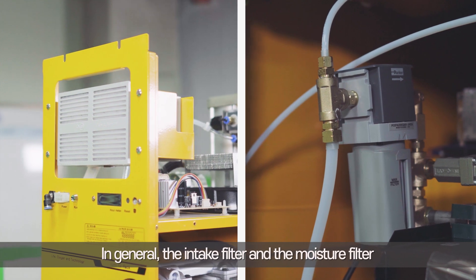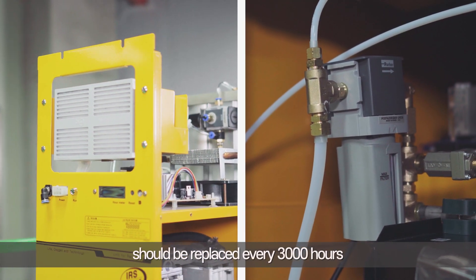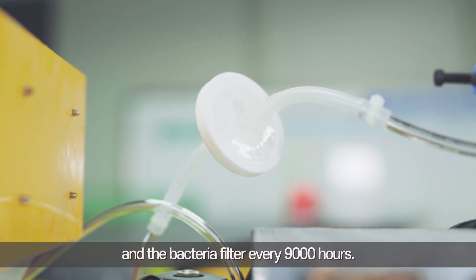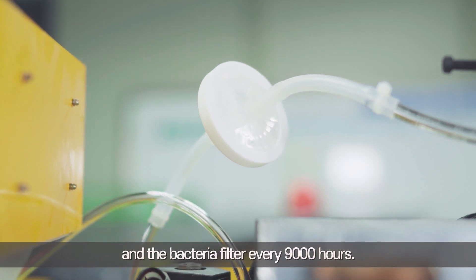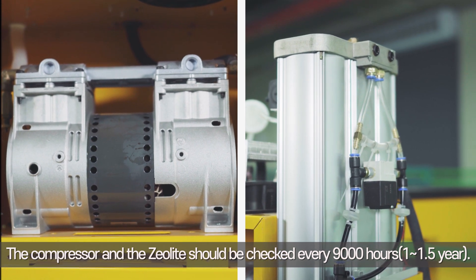In general, the intake filter and the moisture filter should be replaced every 3,000 hours, and the bacteria filter every 9,000 hours. The compressor and the Zeolite should be checked every 9,000 hours.